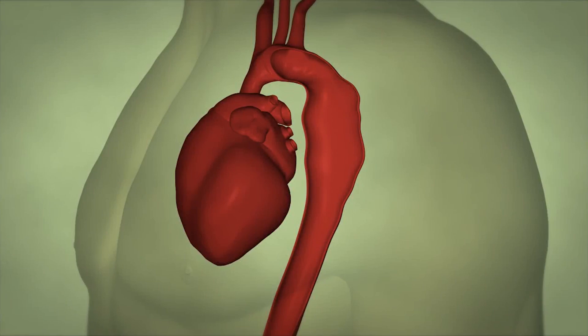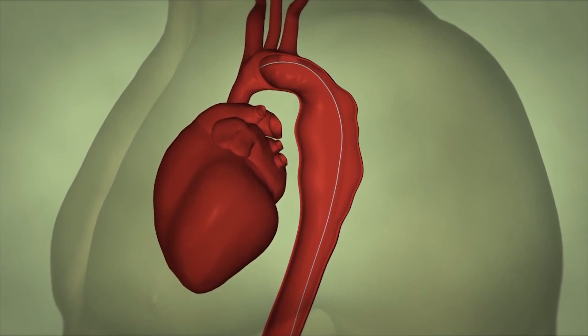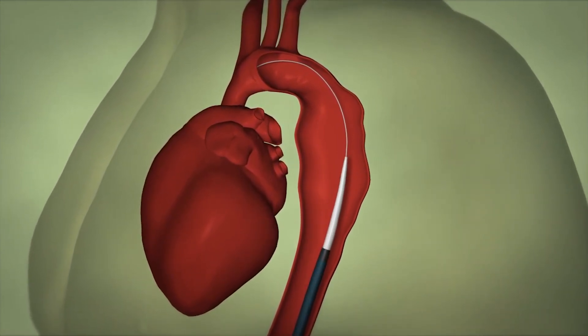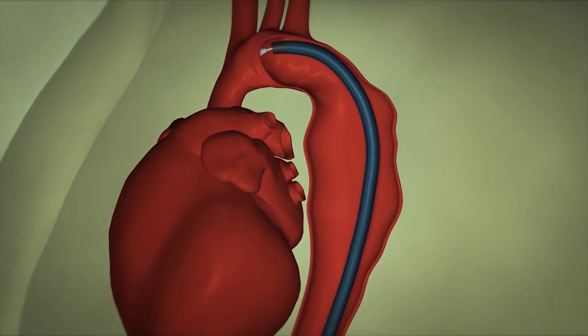This is a rendition of an aneurysm in the descending thoracic aorta. A wire is being inserted from the femoral artery in the groin followed by the main endovascular device inside the blue catheter you can see moving upwards.